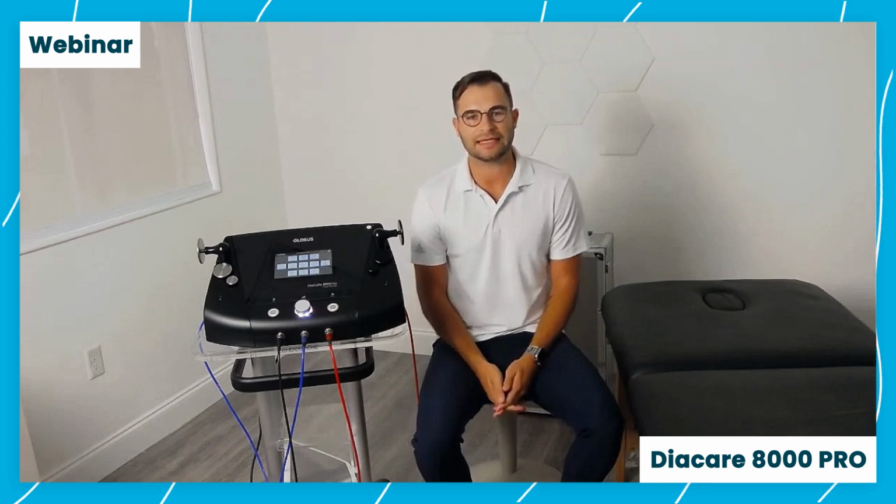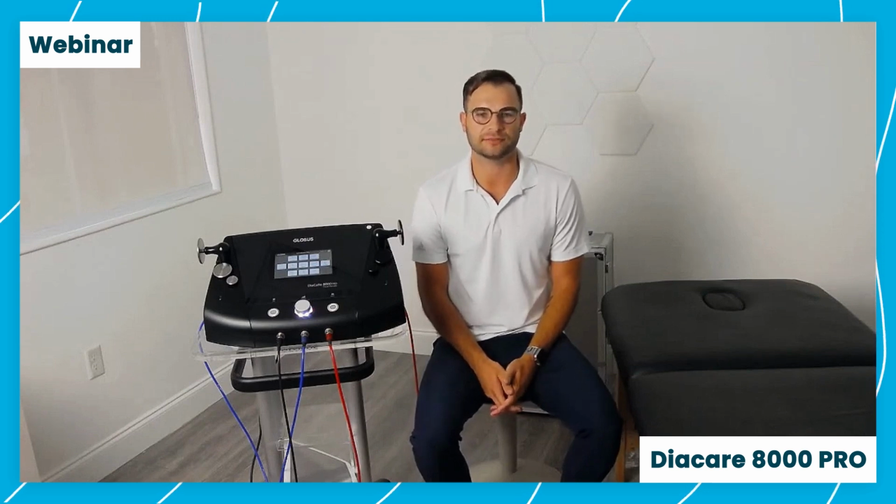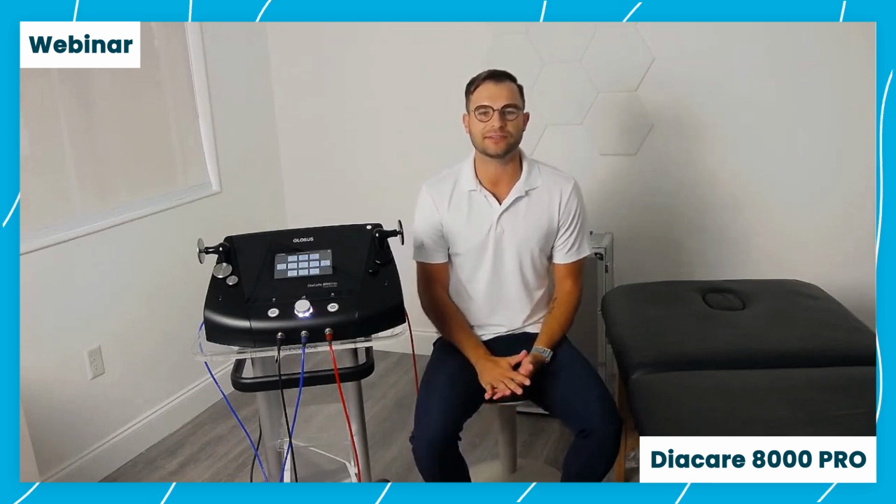The therapeutic effects of Diacare therapy include increasing biostimulation, healing, and tissue regeneration, while at the same time we're trying to decrease things like inflammation, edemas, muscle tension, contractions, and also joint stiffness, thus making the body move better, to help your patient through the other areas of your practice.